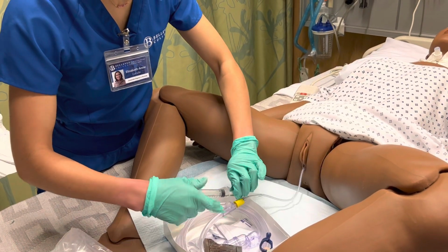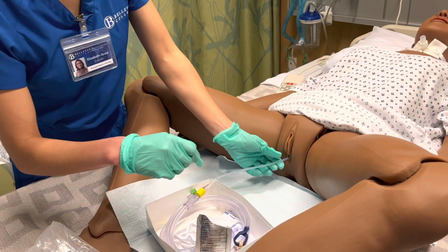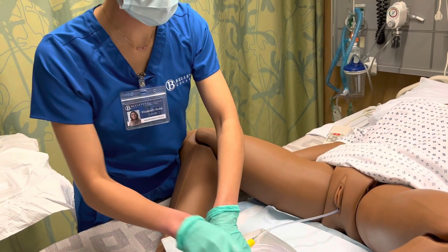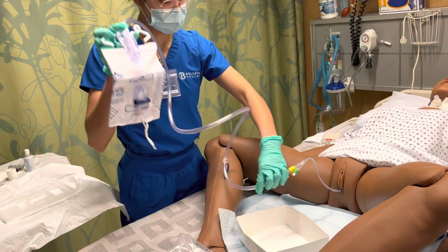And then we'll detach this. We can toss that. And then we'll make sure that this is secure in the correct spot there. Toss that. And now I am done being sterile.